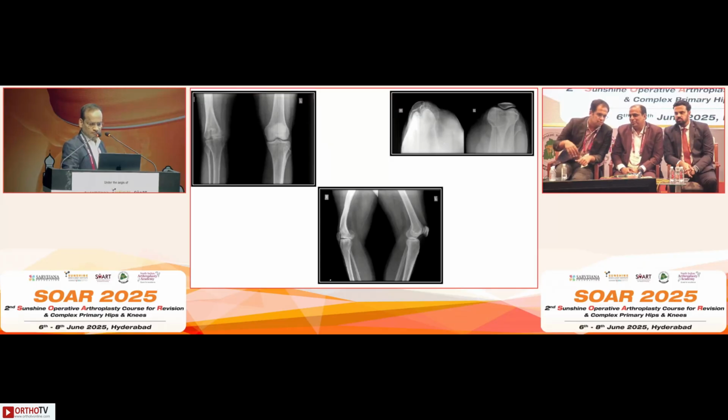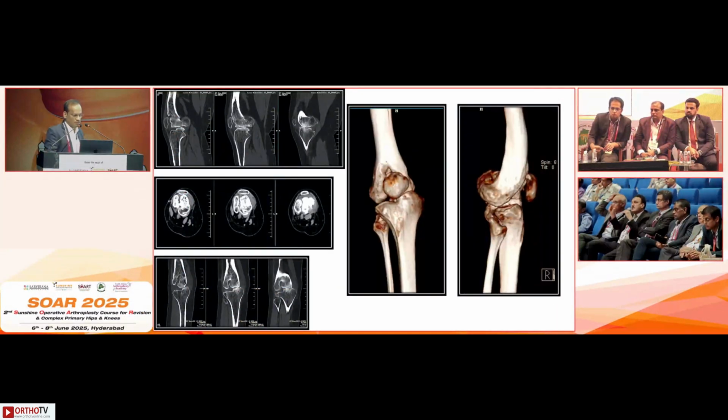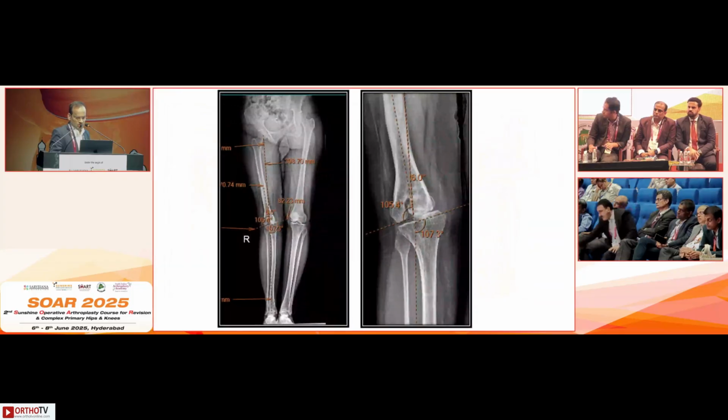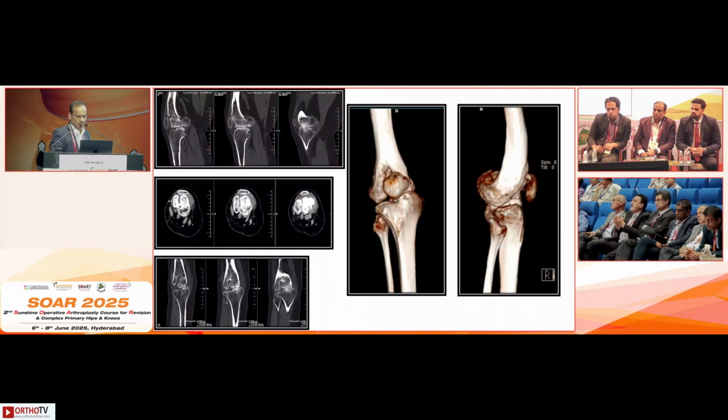Yeah. And you can also see the patella is almost subluxating. That can still be managed, but the procurvatum will stop you. You can use only a very small femoral stem if you have to use one. Samir, this femur is also deformed, and the medullary canal is somewhat sclerotic, so you cannot use conventional instrumentation.